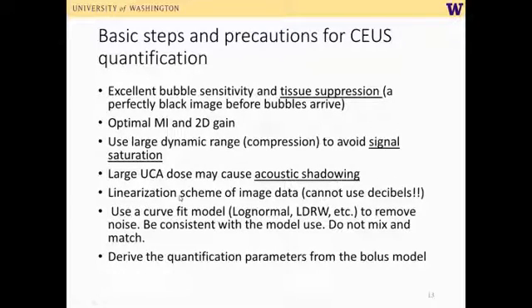Now, the linearization scheme is also important, and please make a real good note here. We cannot use decibels. We have to use the absolute linear data. Then we use a curve fit model, and that may be a log normal, an LDRW, or anything. But please make sure that you are consistent with the model used. You must use the same model throughout the analysis because you cannot mix and match. And finally, we can derive the quantification parameters from the bolus model, just like I showed you in the previous slide.